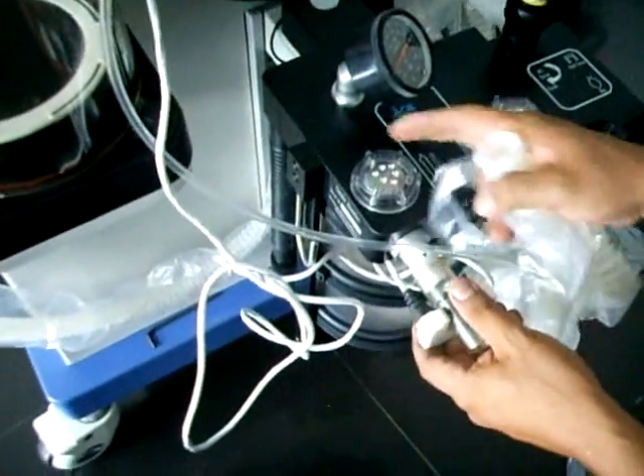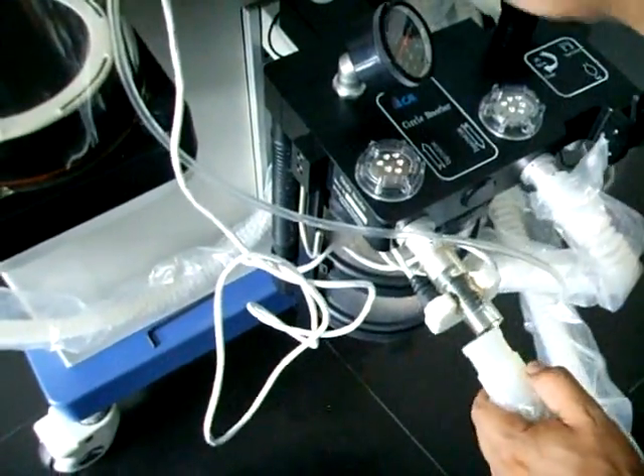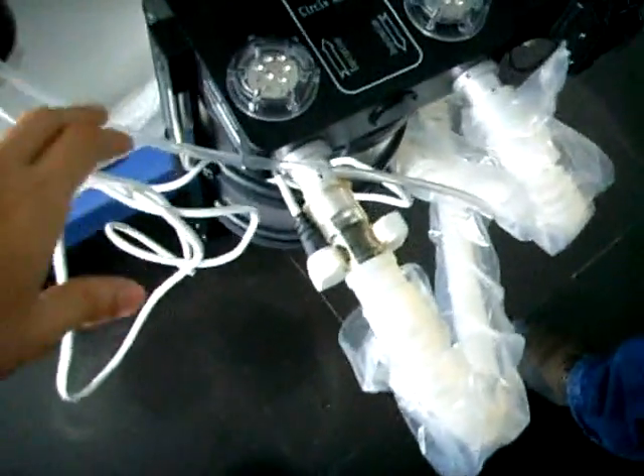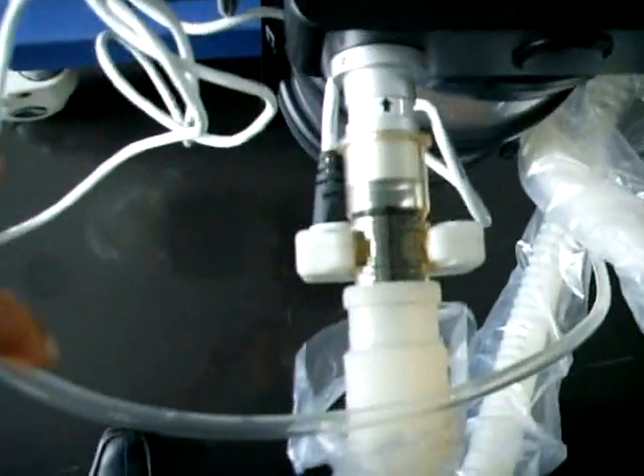Este sensor, por medio de la turbina, debe ser conectado entre la válvula espiratoria y el circuito de paciente, para poder realizar las mediciones.